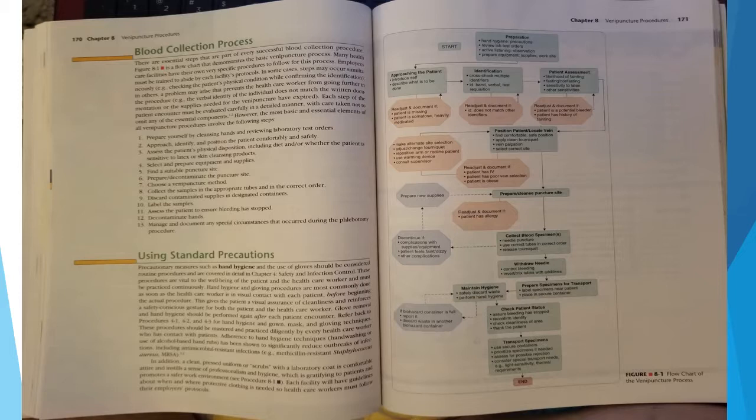However, the most basic and essential elements of all venipuncture procedures involve the following steps. Number 1, prepare yourself by cleansing hands and reviewing laboratory test orders. Number 2, approach, identify, and position the patient comfortably and safely. Number 3, assess the patient's physical disposition, including diet and or whether the patient is sensitive to latex or skin cleansing products. Number 4, select and prepare equipment and supplies.